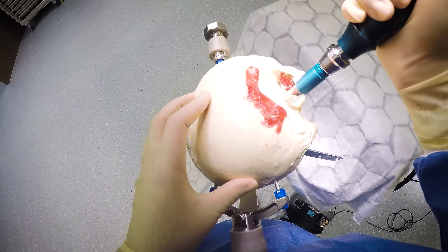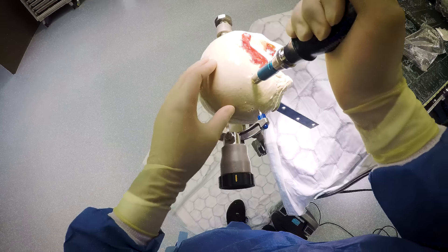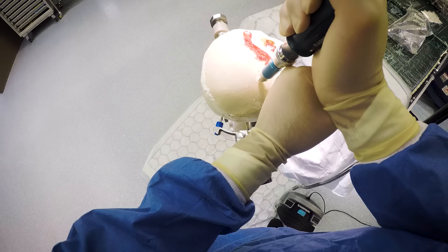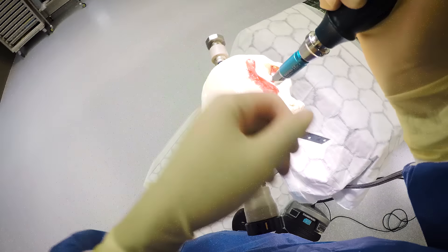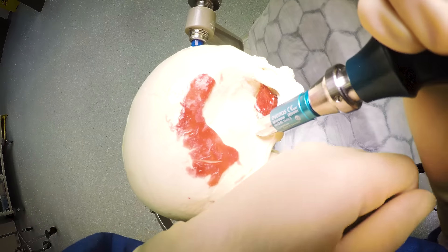You can place burr holes in lots of different positions — this video is about how, not where. Using one hand is relatively unstable, so always try to fix your hand down or support it with your other hand. That'll stop you from sliding.